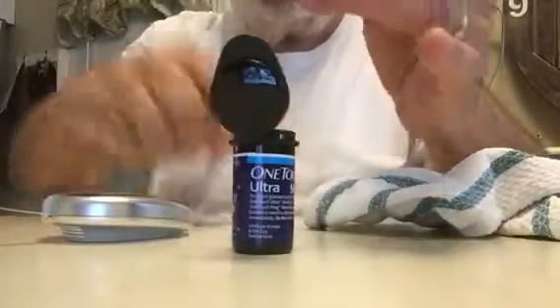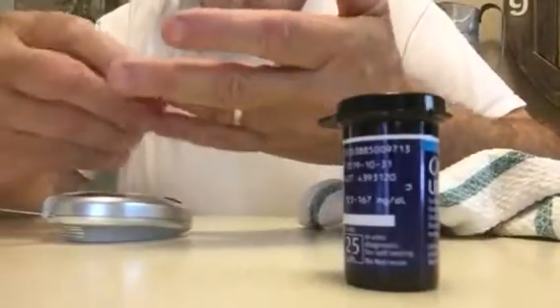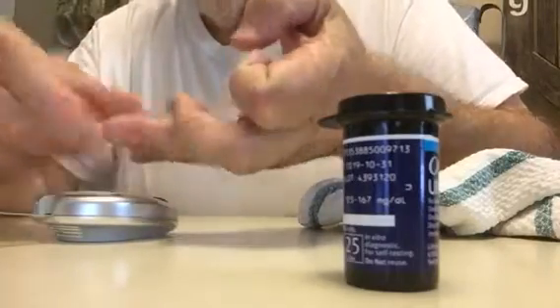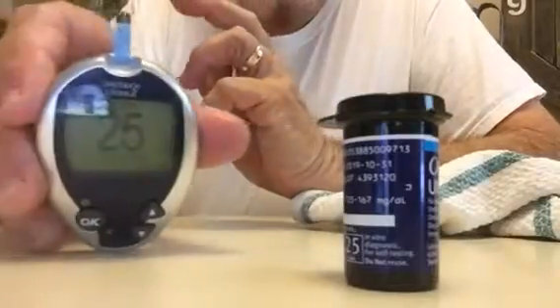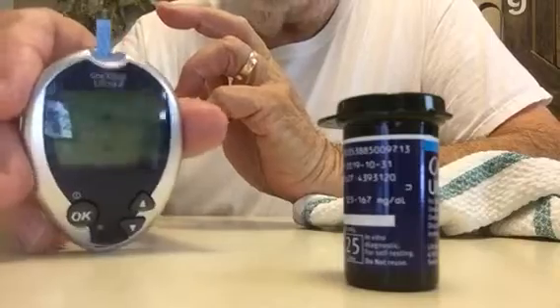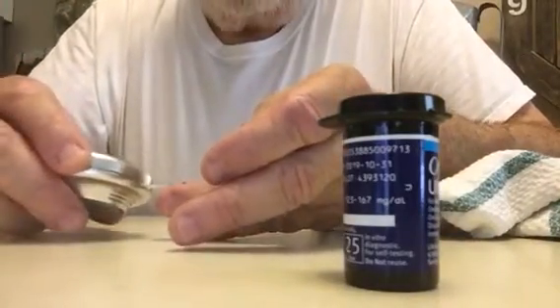Usually I have the strip ready in there before I get this far, but I'm going to get a little more blood on there. I press the strip in and the meter says 25, which tells me it's all synchronized. Check your blood.